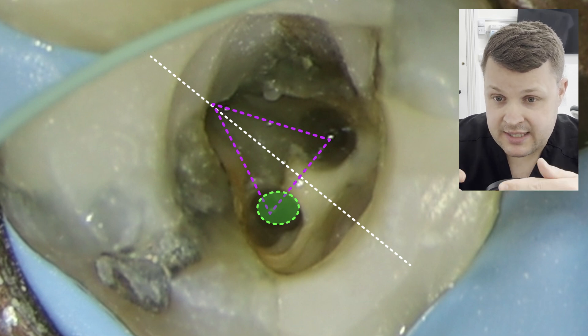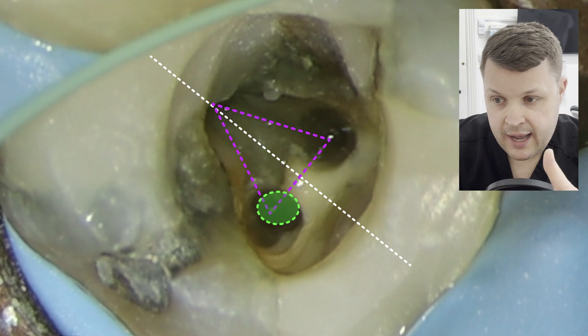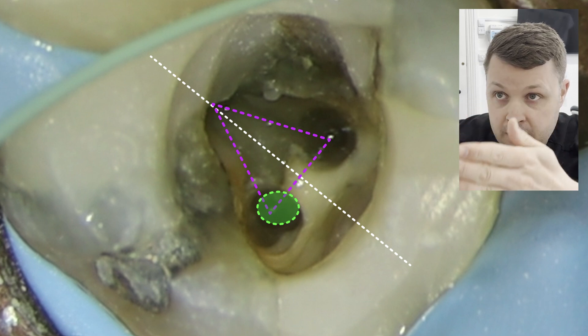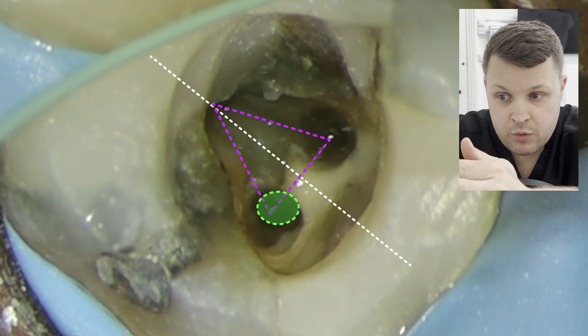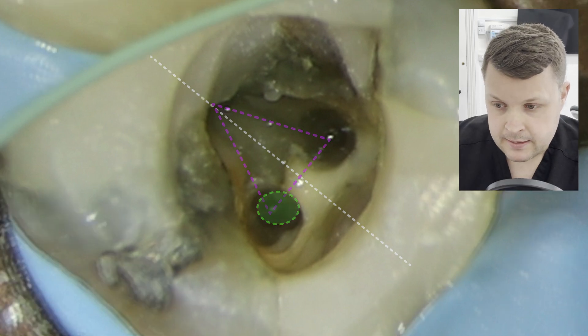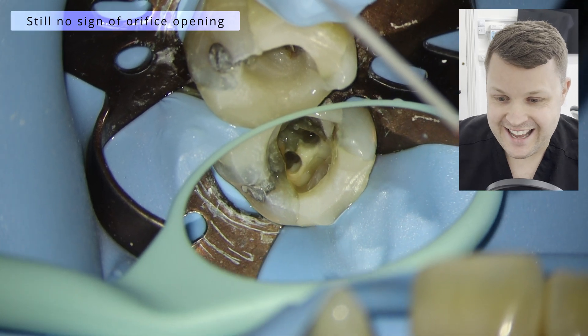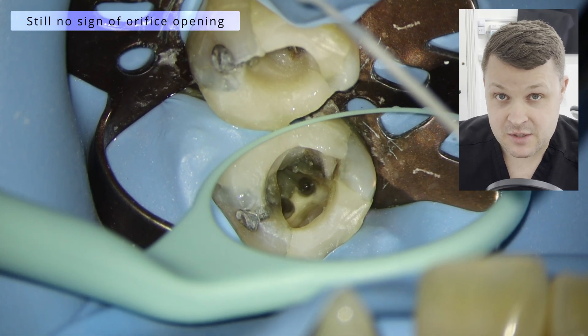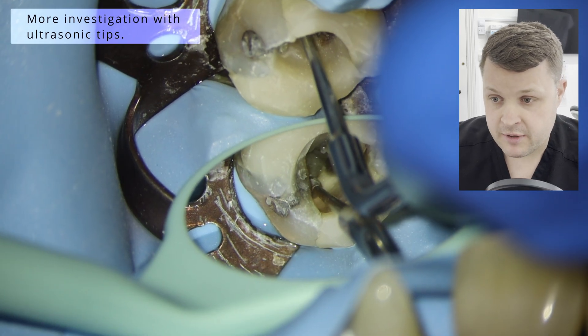And this kind of circle here shows where we should be looking. Actually, I was erring on the side of looking a bit more mesially in this canal, because I thought the two canals joined. Sometimes when you take a lot of dentin away, because of the curve of the canal, the orifice as you remove it moves sort of more mesially. And we'll see here that that wasn't the case, but that was my thinking at the time.